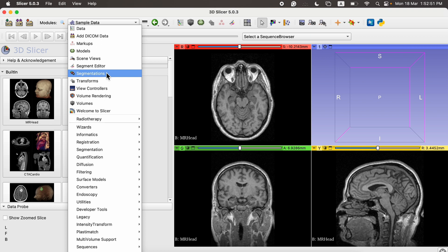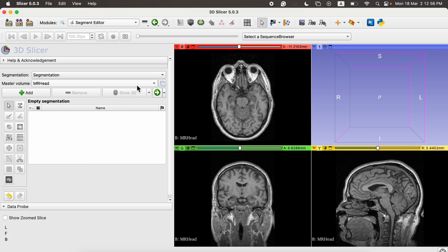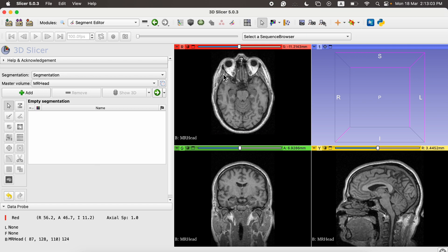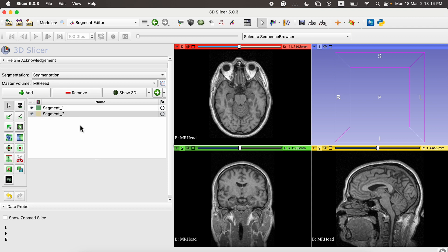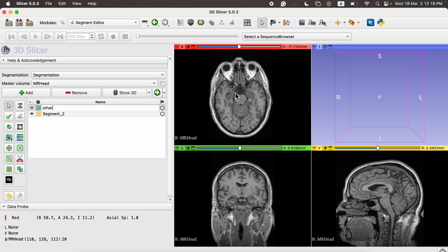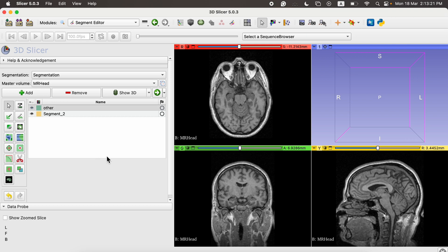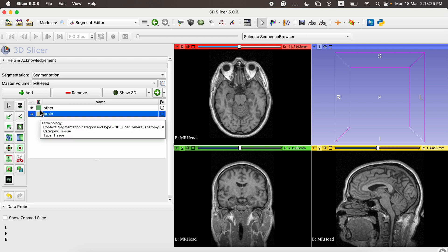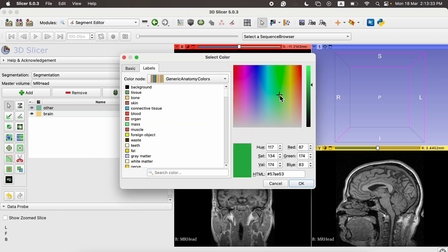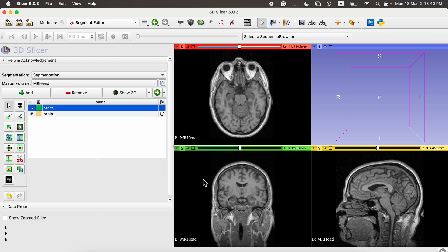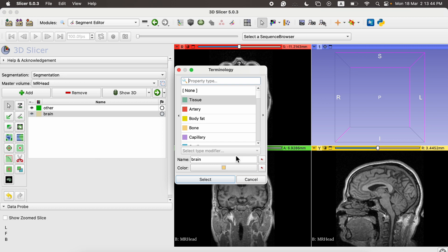On the other hand, using Segmentations we can visualize in 3D and look at the region in 3D format. First we click on the Segment Editor button. We are going to delineate two regions: the first is artifacts — containing the eye socket area and the back — and the other is the brain region. I'll name one 'other' and one 'brain', and change their colors to our liking.